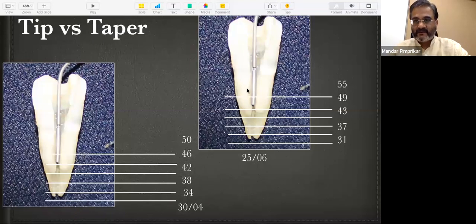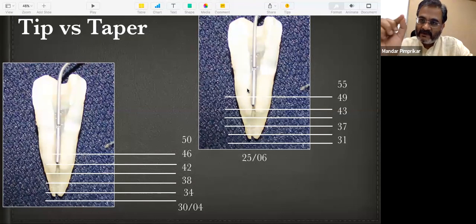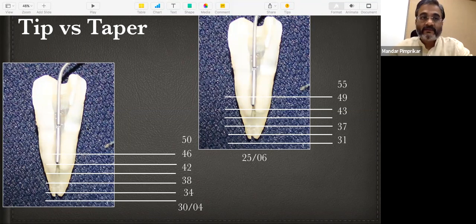So if you look at the fluid dynamics, then keeping the apical foramen as small as practical and playing with the taper depending on each and every root's thickness will allow you to clean the root canal system in 3 dimensions. Because there are going to be more variations in the apical 1/3, I would not recommend you to increase the apical diameters to 35 and 40. Better keep it as small as practical and play with the taper, because taper will decide the volume of irrigation.